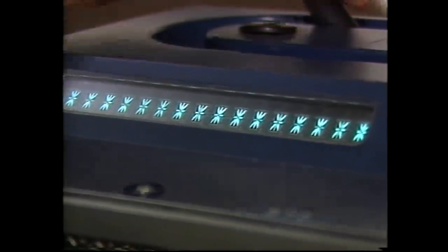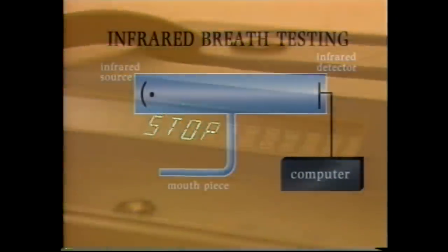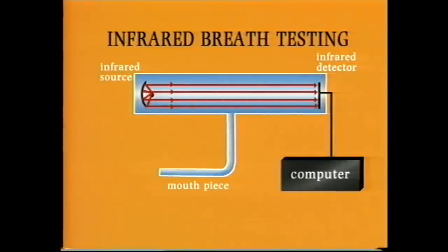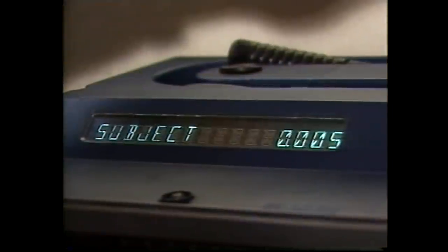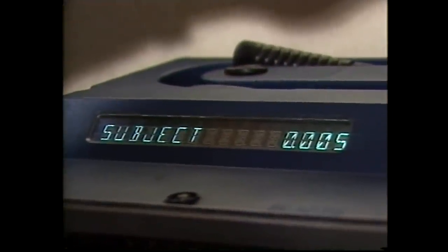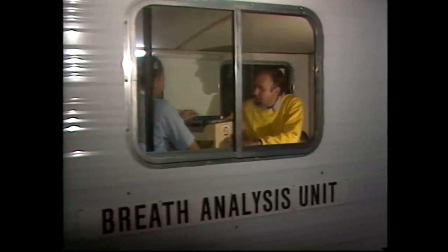The police officer takes the driver to a van where a much more accurate method is used to check the alcohol reading. In this case, it's an infrared breath testing machine. Once again, the driver blows through a tube and the machine tells you when to start and stop blowing. Inside the machine, there's a hollow cylinder with infrared rays being beamed from one end to the other. Alcohol vapor interferes with the infrared rays and the computer calculates the blood alcohol reading. Same reading again, and this machine is as accurate as a hospital blood sample.